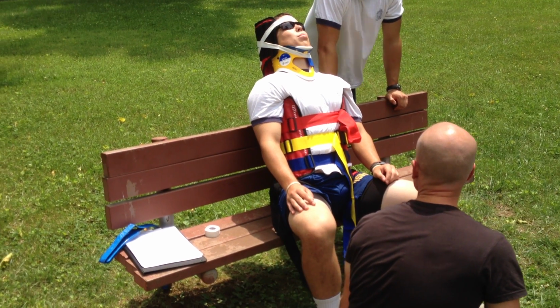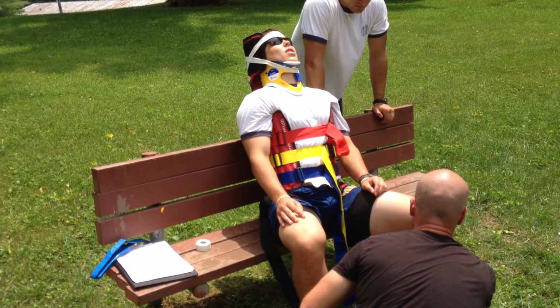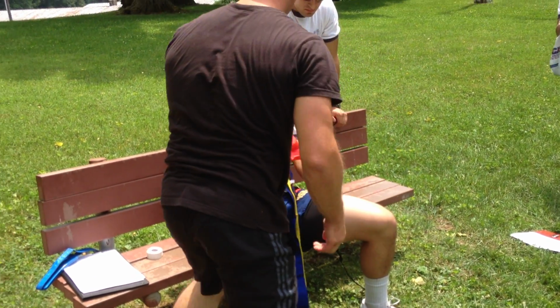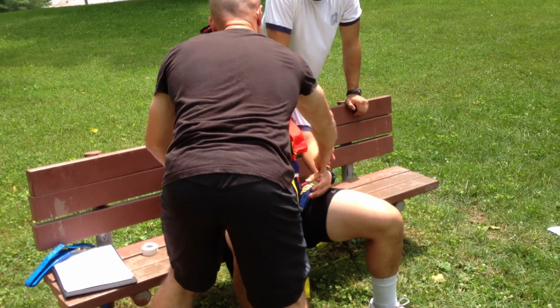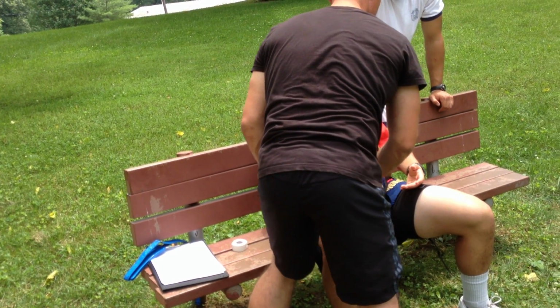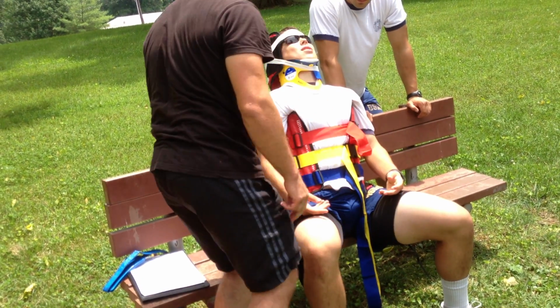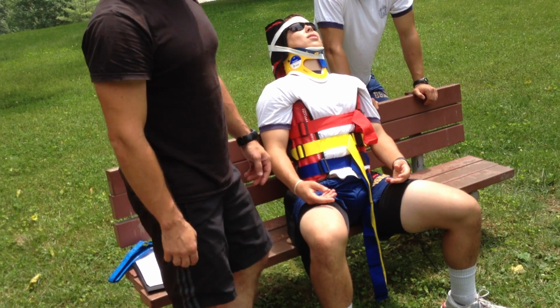Which toe, sir? Big toe right. Over here. Big toe left. Still warm? Can you gas pedal? Can you pull up? All right. And let's see here. Good feet or good radial pulses? Yes. Can you wiggle your fingers? Which finger is this? Which finger is this? Squeeze, squeeze. All right, that's good. I've checked my CSMs. Now we're ready to move the patient.